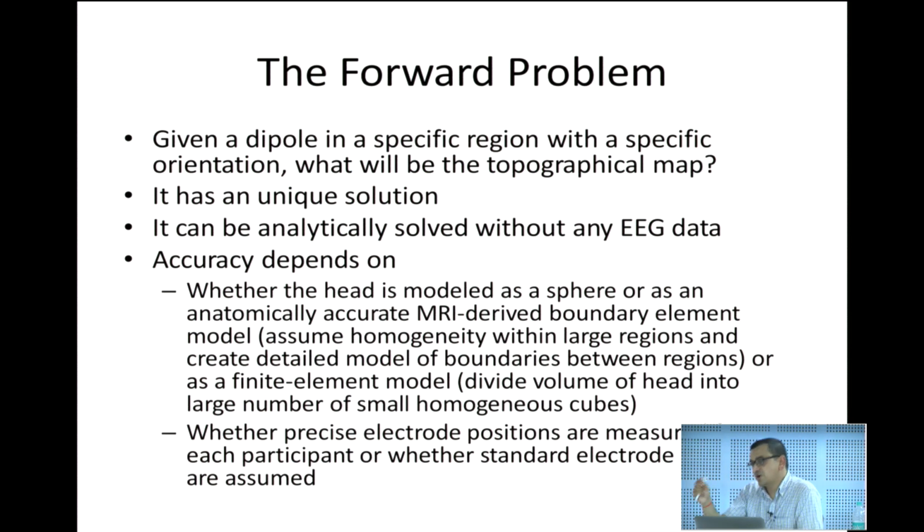That's right, because you also have the density of the cerebrospinal fluid, a thin layer between the outer layer of the brain and the lower layer of the scalp. You need the density of the CSF if you want to model that, because before it reaches the scalp, the signal has to propagate through complicated geometrical structures and finally some fluid. As far as I know, you have a decent approximation if you have the individual MR images, provided you know where the brain sources are located. So this is the forward model.